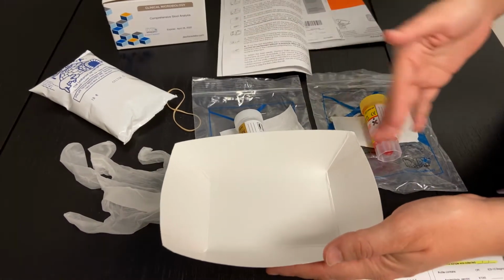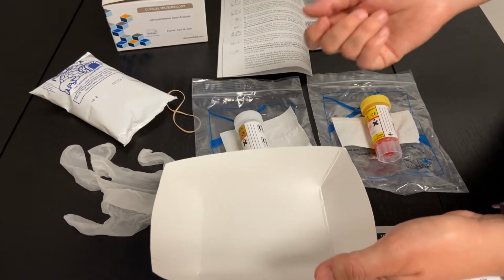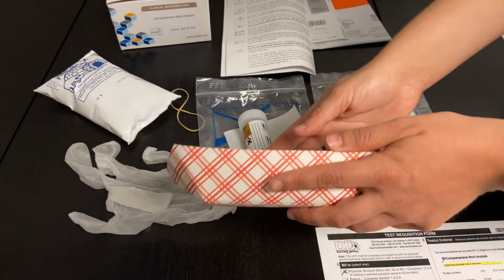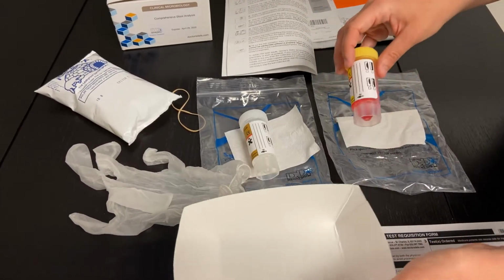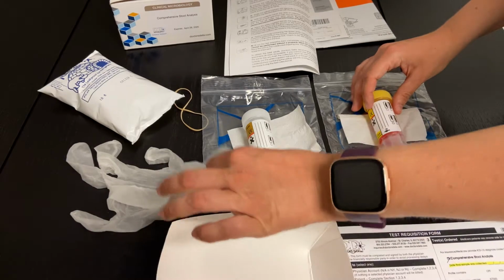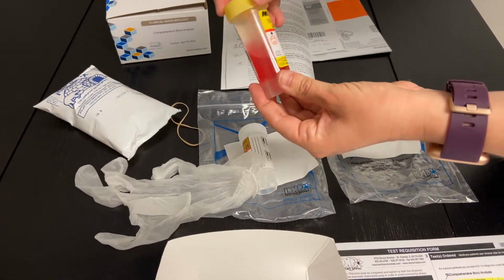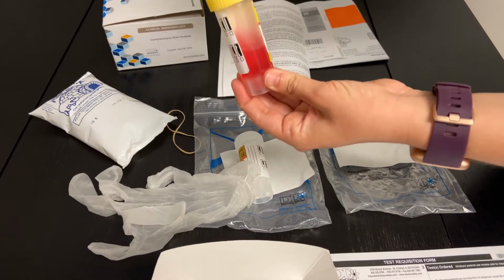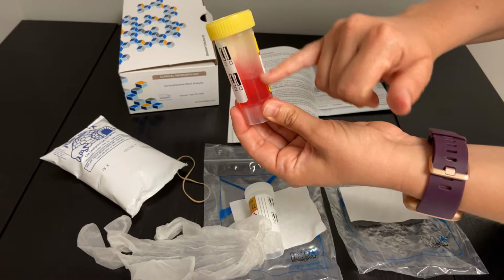It's okay if the stool is looking more watery than you're used to, or whatever the case might be. You'll just collect your stool into this boat here. There are 2 different vials in order to collect this sample. So you'll have your stool in here. You'll put on the gloves. You'll then first take this yellow top vial here. You'll tap down on the vial to make sure that all the liquid has dropped into the vial.